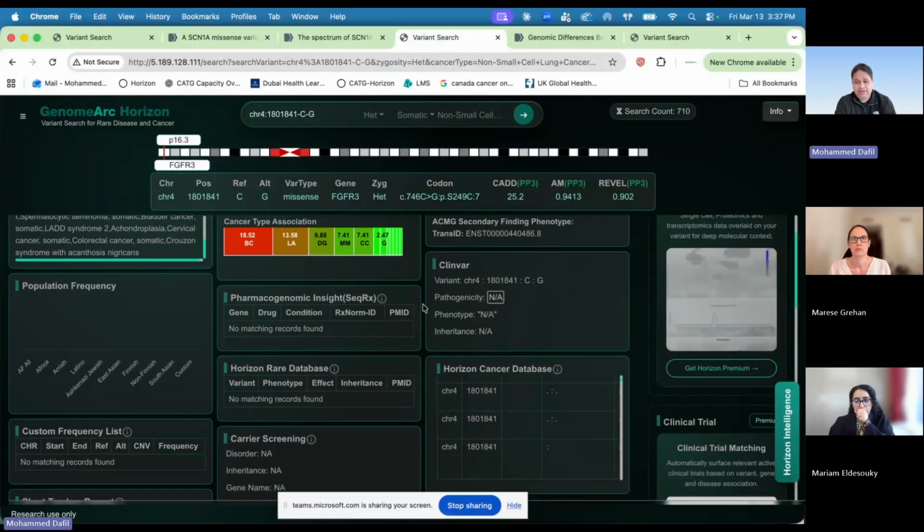And for cancer, we don't know all the driver mutations. So a lot of those cancers, we don't know which one is the driver mutation. So this kind of proprietary database that we are bringing in, and also the algorithmic development that we are doing, is aimed to identify those causal driver mutations.